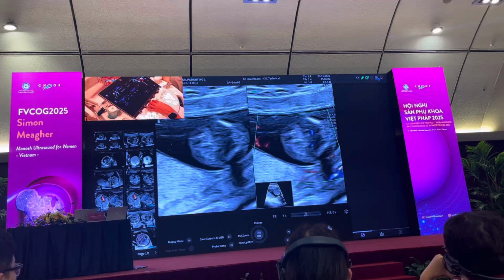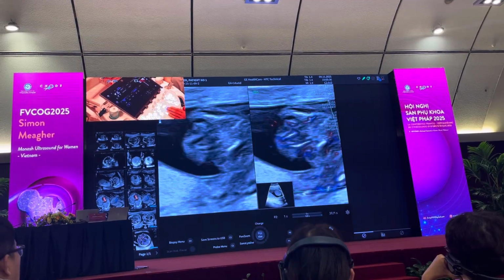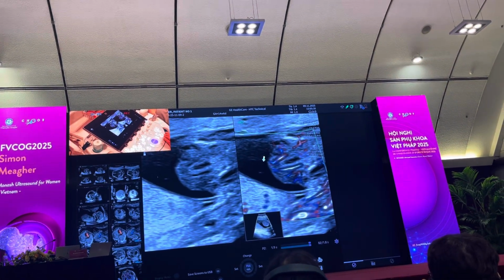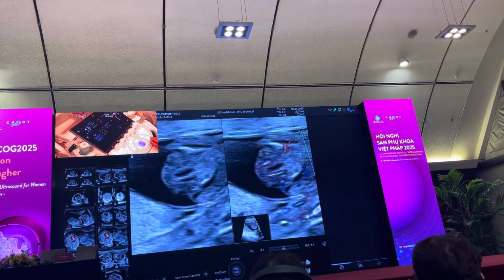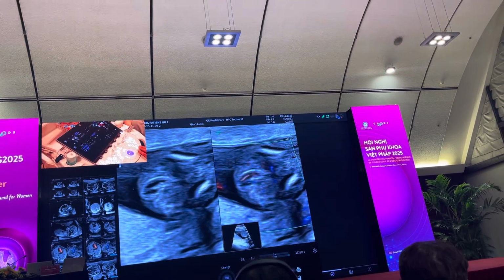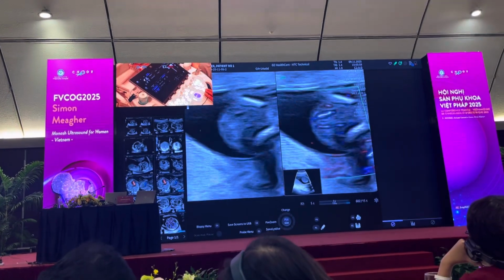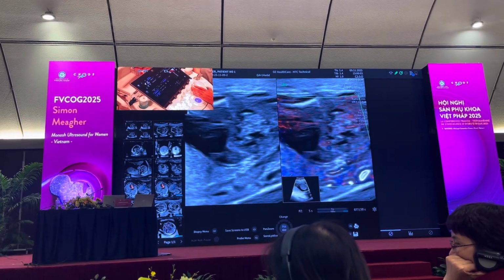I now want to look at the urinary bladder. There's no urine in it, so I would wait until this fills. It's beginning to fill now. But I would not go home until I see the urinary bladder in this baby. I see the renal pelvis at about that age, so I know there's almost certainly urine production, but still, the cause of an empty bladder would be bilateral renal agenesis number 1, bladder exstrophy number 2, and cloacal exstrophy number 3. But I look at the bladder, and both umbilical arteries there look normal.